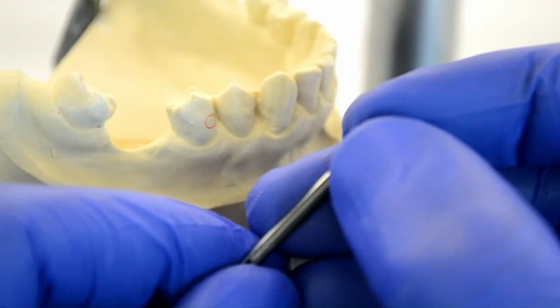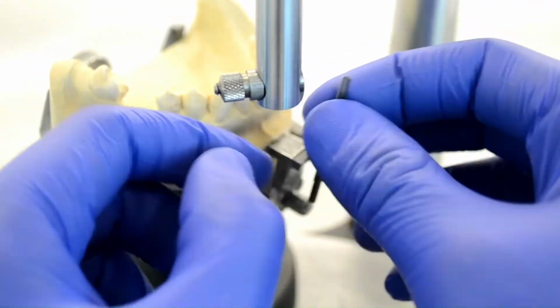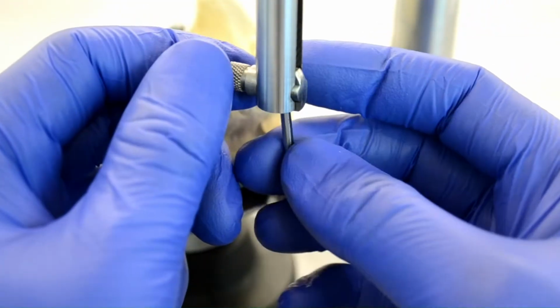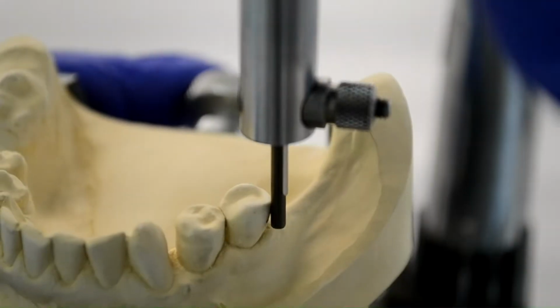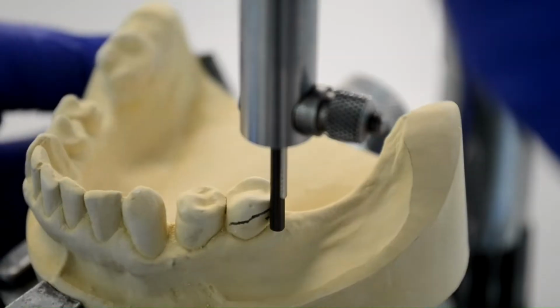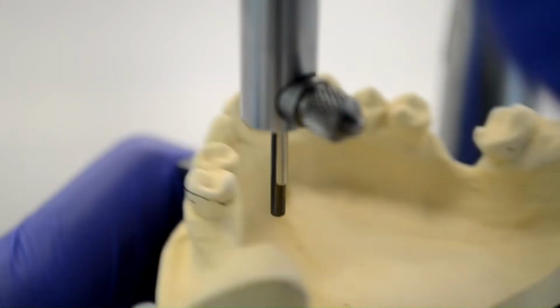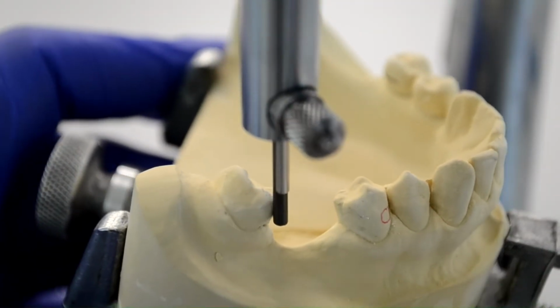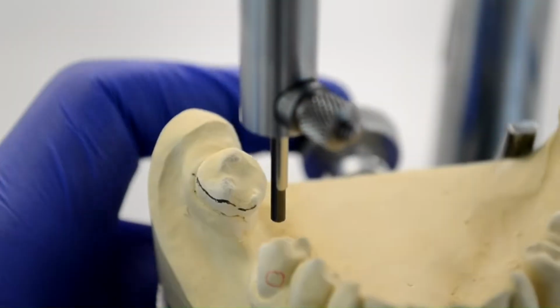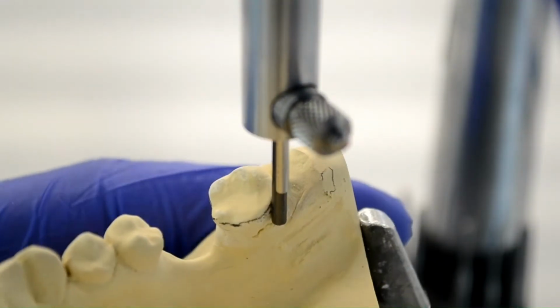Now that we're done identifying all the different undercuts, it's time to draw the survey line. This is done using the lead and the metal sleeve. They're both detached together and then attached to the mandrel. To correctly draw the survey line, we're going to ensure that only the side of the lead contacts the tooth and not the tip. The side of the lead is rubbed against the highest contour of each tooth, and that leaves a line called the survey line. Anything under that line represents a degree of undercut.